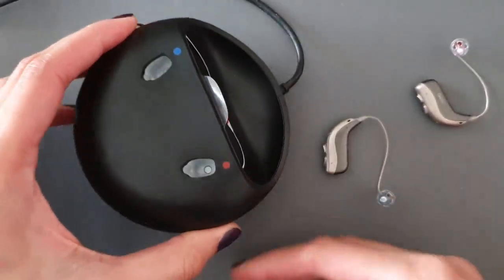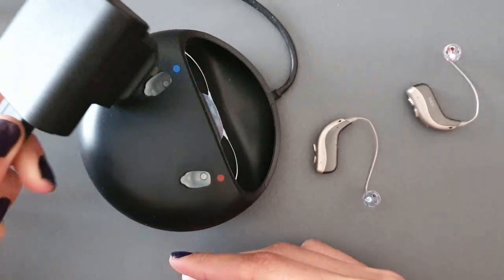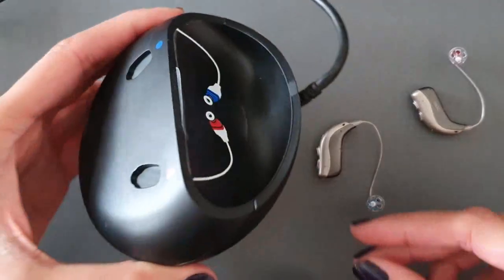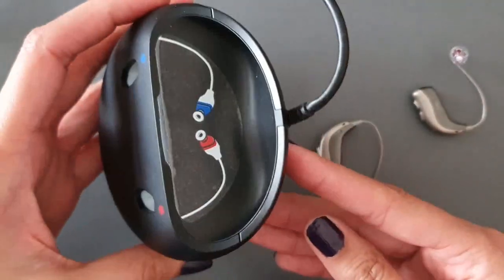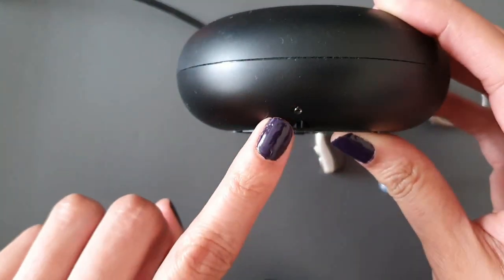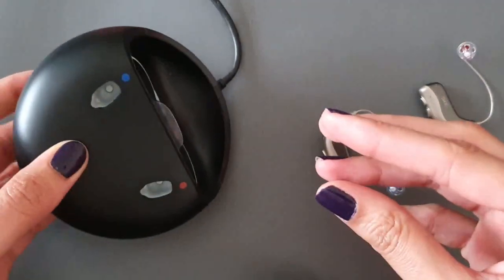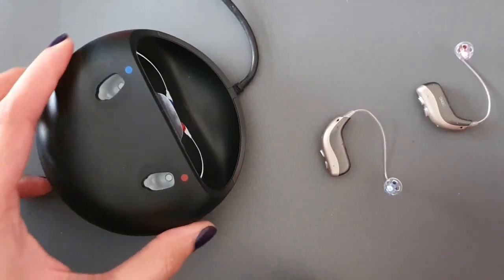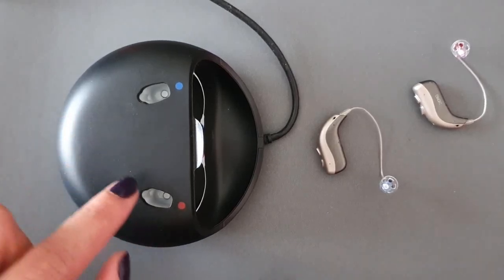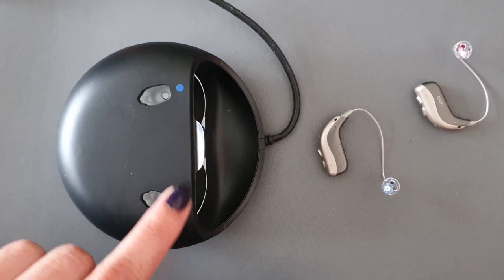The charger is connected to a cable and plug which goes into a power supply. When connected, there's a little light on the bottom that will turn green to confirm it's sufficiently connected to power. You can then see in your charging dock there are two holes.